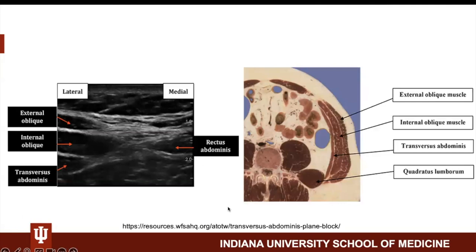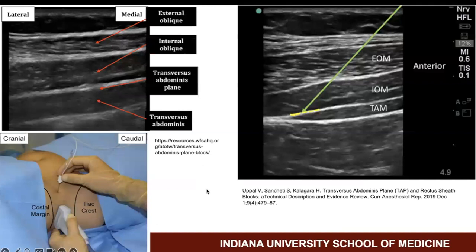Start by placing the ultrasound probe in the mid-axillary line between the iliac crest and costal margin. The three muscle layers should come into view and look something like this. As you advance laterally, the three muscle layers will be seen running parallel to each other.